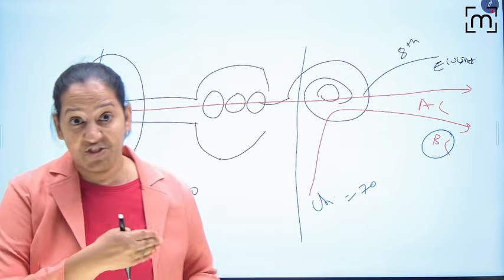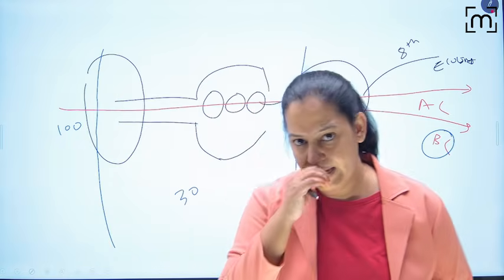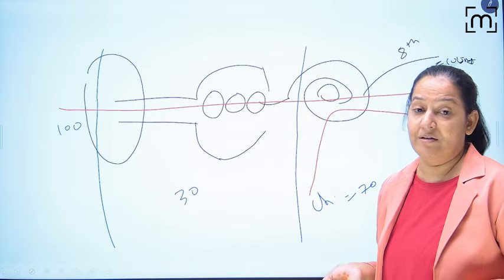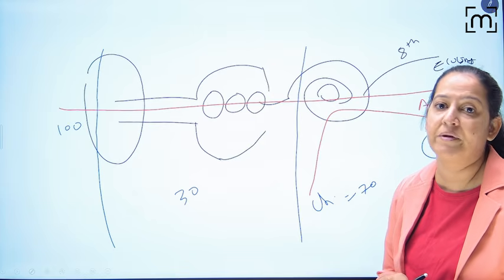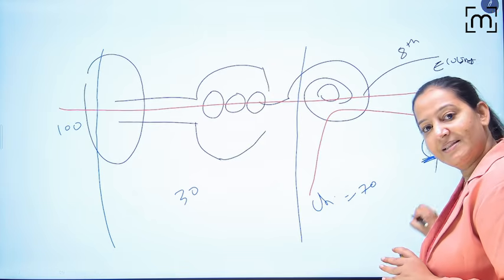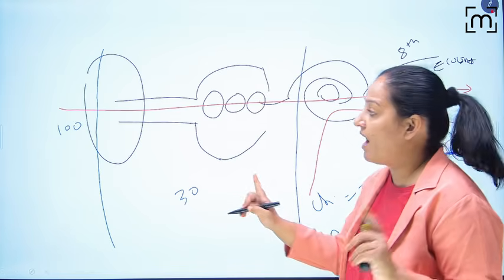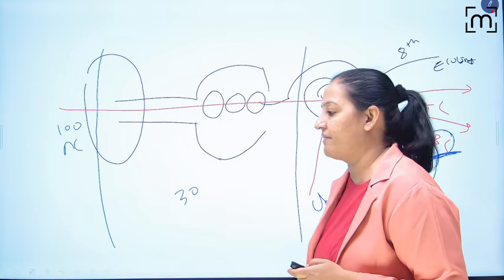Nobody is going to ask you such a detailed concept, because you will learn this when you do MS in ENT. But as it is given in the standard textbook, you never assume what you are going to get as MCQs in your competitive exams. You got my point? So whatever is the answer of BC, that is directly cochlear deafness. But whatever is the answer of AC, AC minus BC is the conductive deafness.